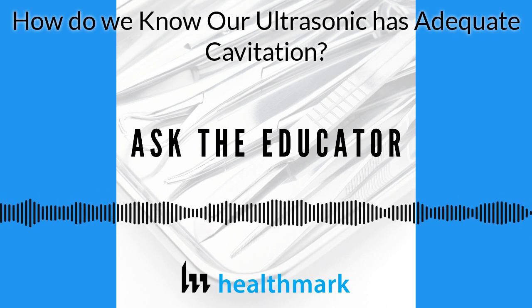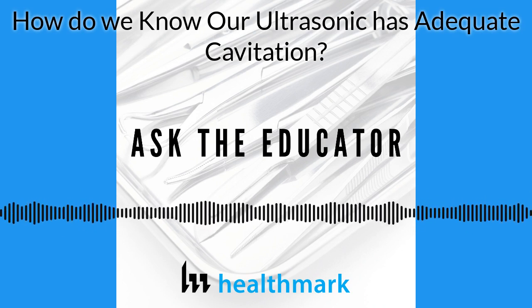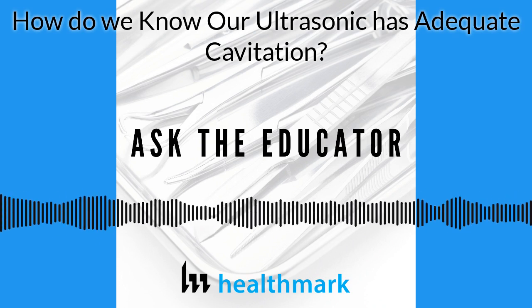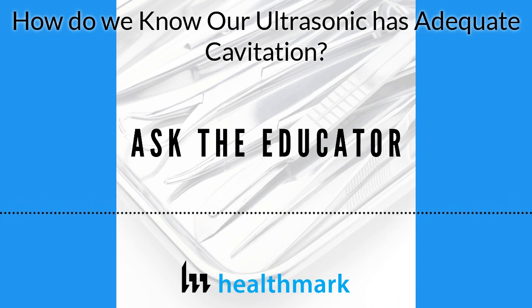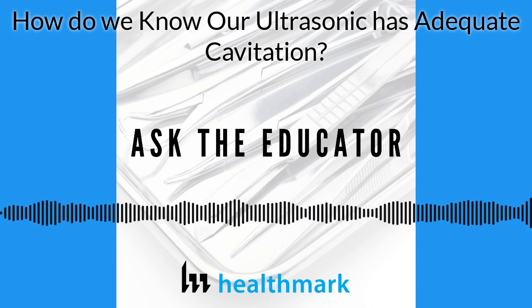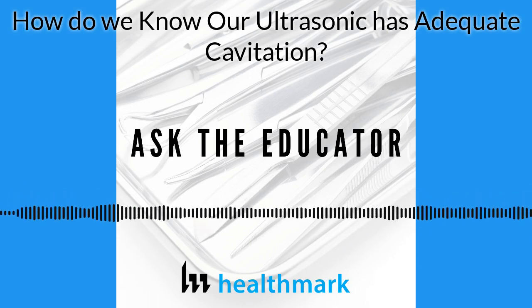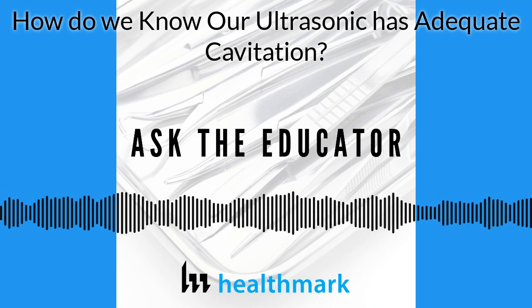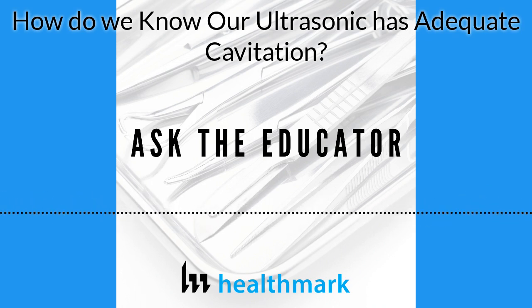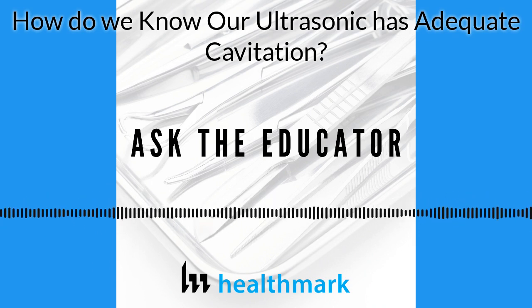People, when they buy their sterilizers, do IQ, OQ, PQ: the installation, operation, and performance qualification. The same thing should be done with the Sonic, and it should be put in the request for proposal that these steps are taken and they must pass certain tests. Because when you're doing your IQ and your OQ, you have to make sure that you're getting cavitation and everything at each level. And the SonaCheck allows you to do that. And thus that can be used in those two steps.